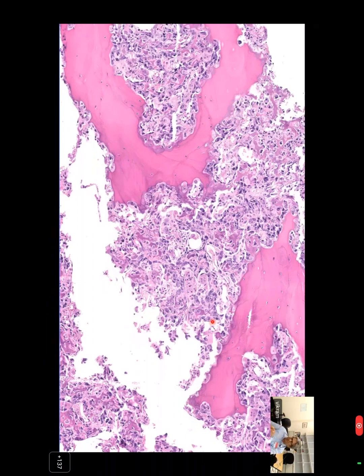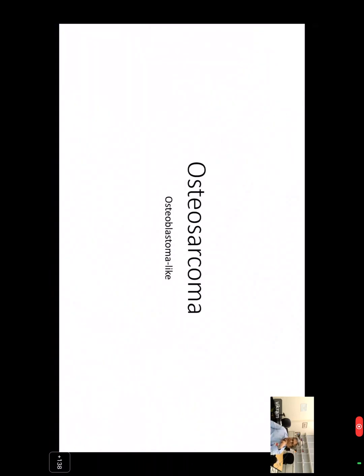So that's sort of the interplay between the radiologist and the pathologist. There are sometimes where the radiologist is not going to be certain. So you can't rely solely on your radiologist. They're very good, but there are times when they just don't have the features necessary for the distinction that we are really looking for. And again, you can do FOSB here. You could do immunohistochemistry or you could sequence it. But by and large, this is still a morphologic diagnosis. It is a highly challenging diagnosis. And I think all of us at some point in our lives, if you do enough referral cases, you will make the error.